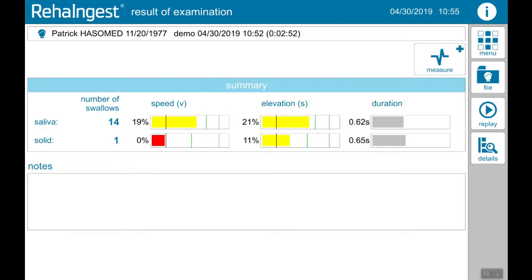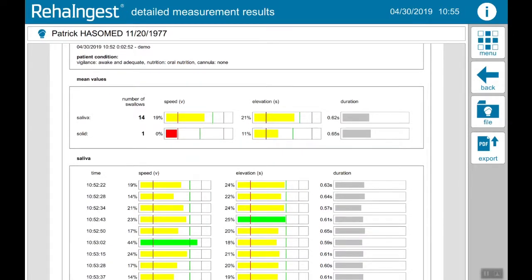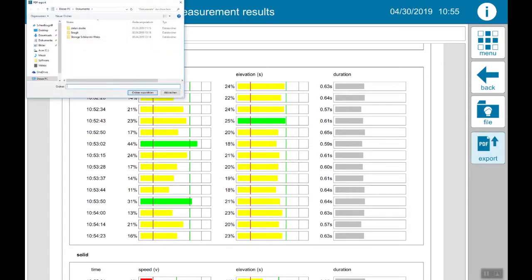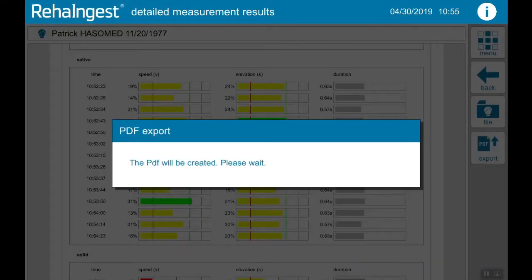To get detailed information of every single swallow, tap on detail. You can export these detailed measurement results as a PDF. To do this, tap on export, choose the folder, and the PDF will be generated.